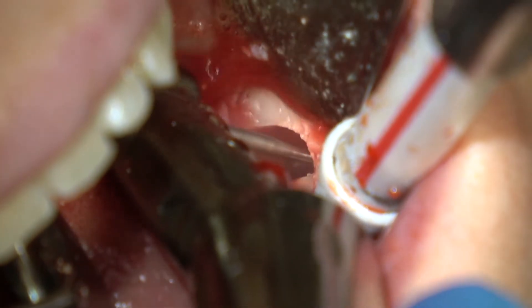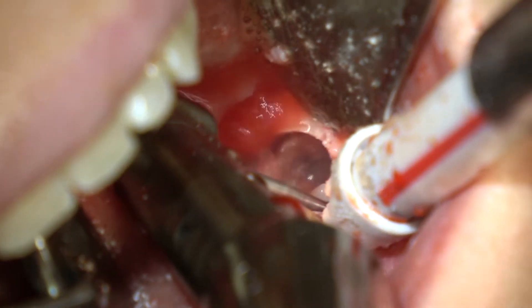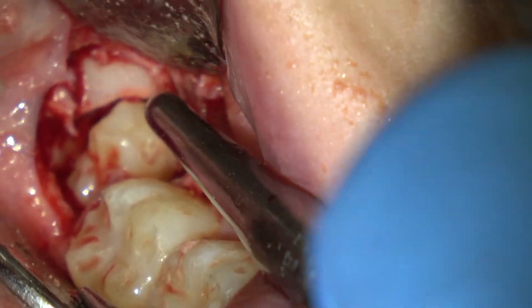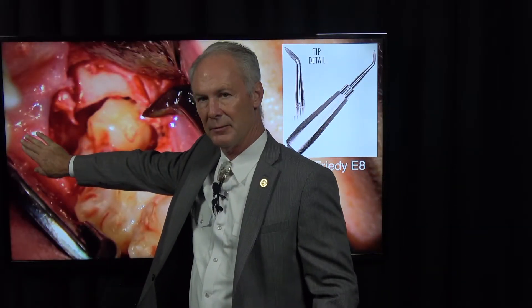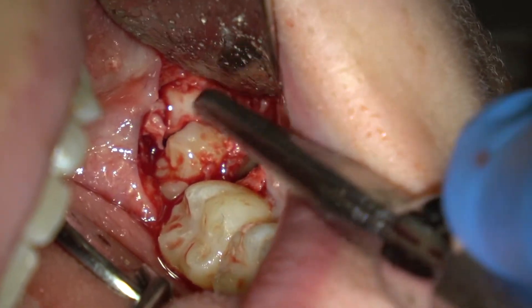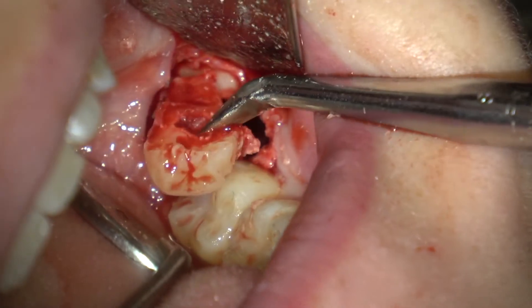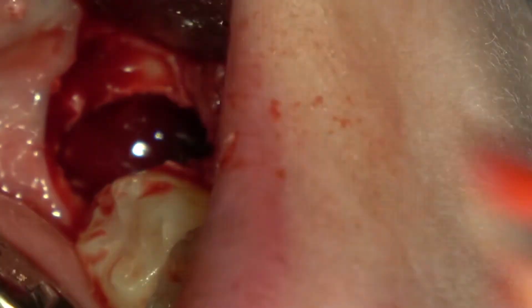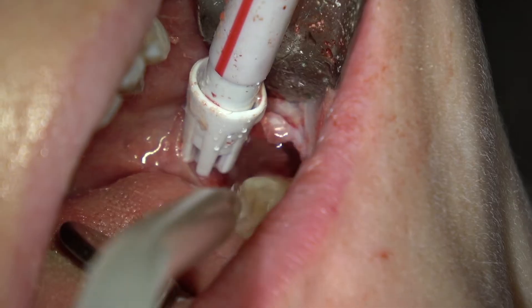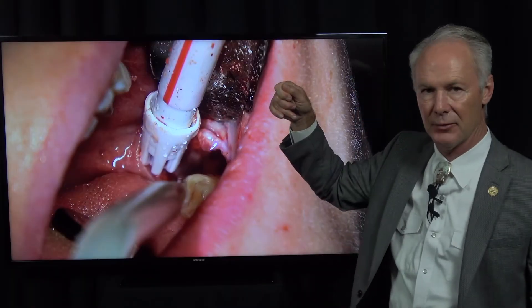Just a little bit right there so you can place your elevator and move that mesial piece out. Here it comes — be sure to protect the airway with your finger, a retractor, something, so that you don't have a piece aspirated. I'm just elevating that piece — see I'm protecting the airway over here. Then you're going to remove, irrigate, and remove the follicular sac with your rongeurs.